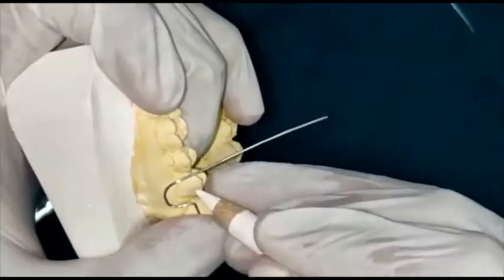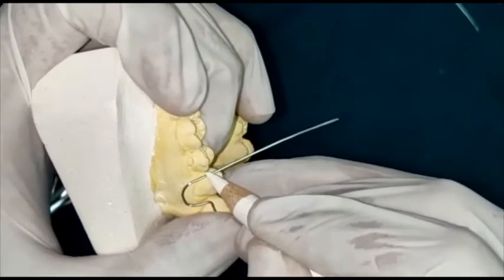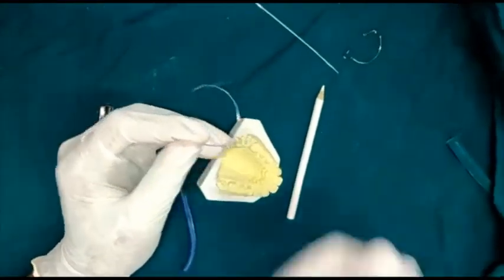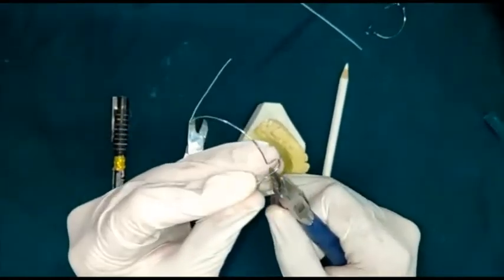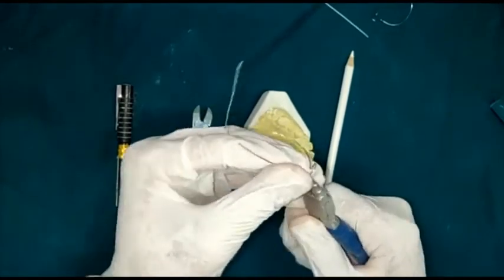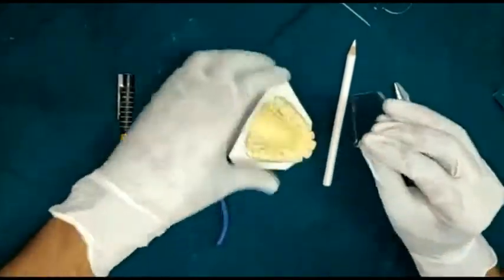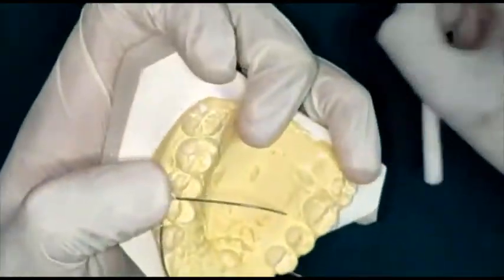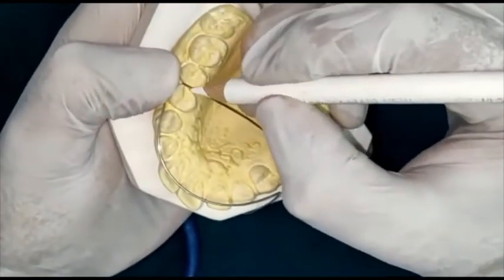For the crossover bend, you will take the marking. As the contact point between the premolars is not round, you have to go for a 90 degree bend. Leaving a little bit extra, you can place it on the cast, taking the other marking on the palatal side.